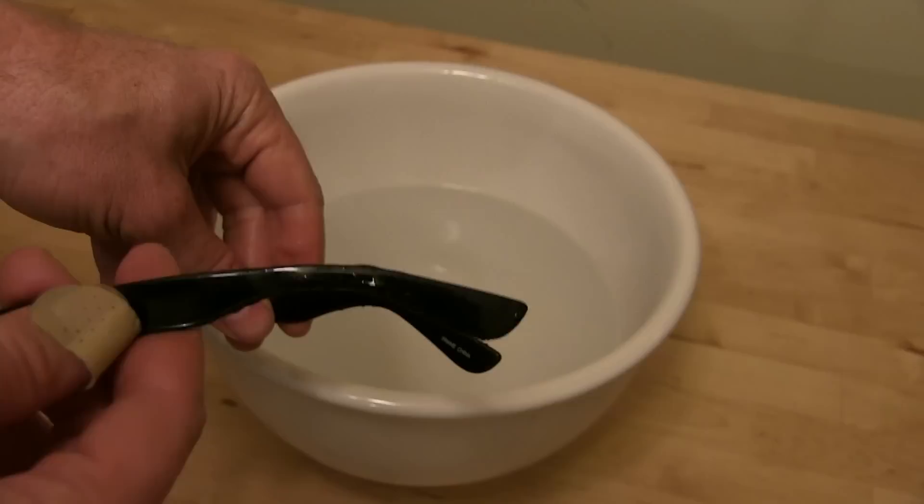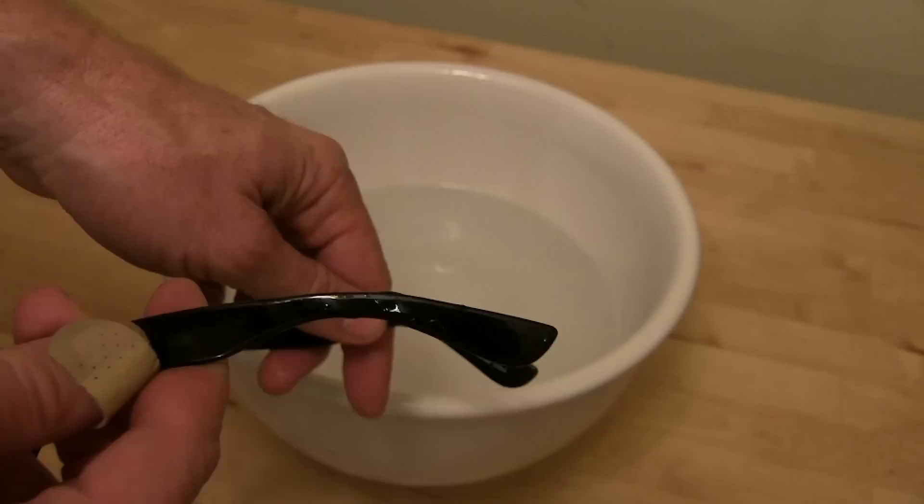And there you go — you can see the difference between this one and this one. You just continue in that manner. I'm going to heat it up again and bend it a little more just to make sure that it comes out nice and smooth.